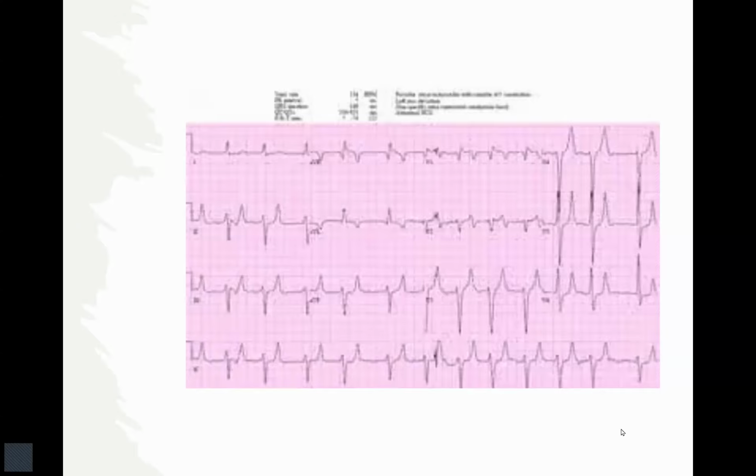And what are we supposed to look for in terms of the P waves? Want to look for small P waves, yeah, in V5 and V6. And even when you look at the rhythm strip, you really can't see any P waves in this one. Yeah, it's really hard. I can't find any. Okay, so that's hyperkalemia. That's the one that everyone's good at.